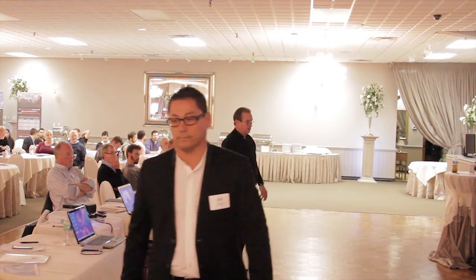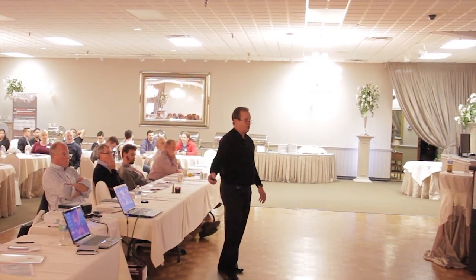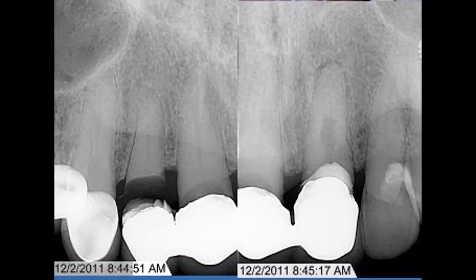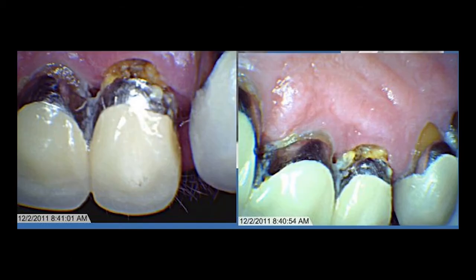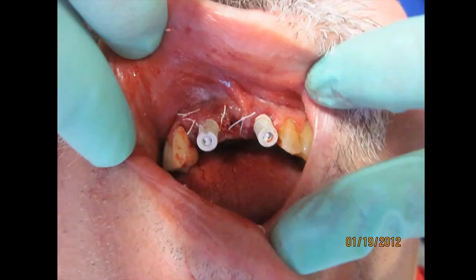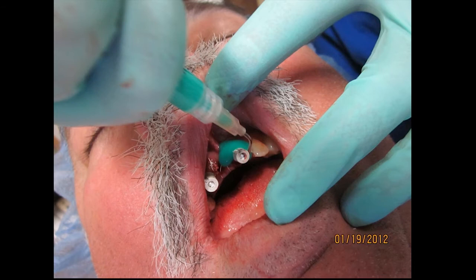This is a case we use as a teaching case in our course — a patient named Norman LeBlanc. He has issues with the anterior teeth, and I don't want to make a flipper or an Essex appliance. We took the teeth out, placed tapered screw-vent implants. These are PEEK abutments from Zimmer. You've got to grind them down so your preoperative impression fits over them to make your provisionals. We're taking a triple-tray impression with hydrocolloid material, then unscrewing the abutments out of the mouth and inserting them into the impression.